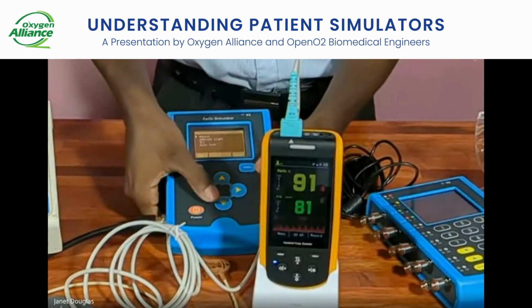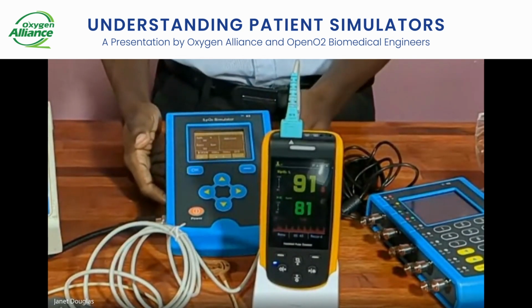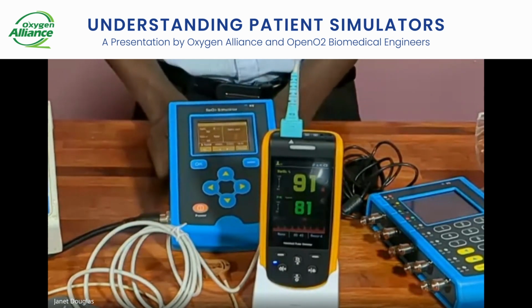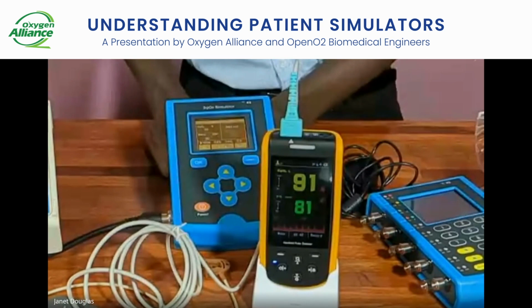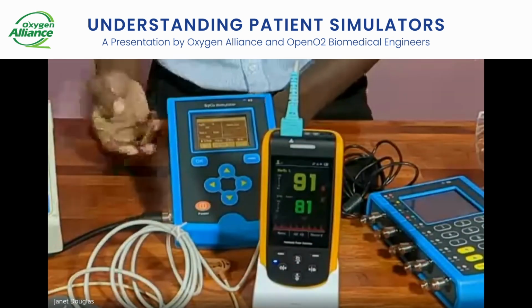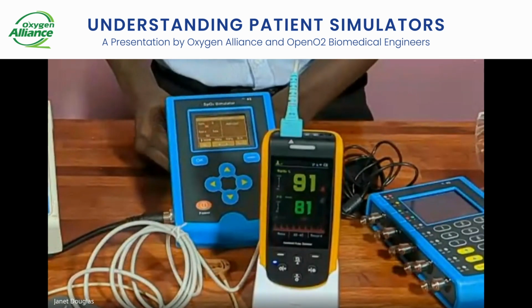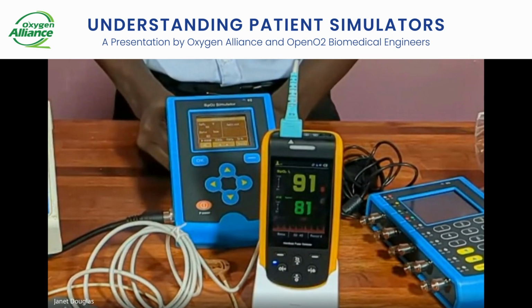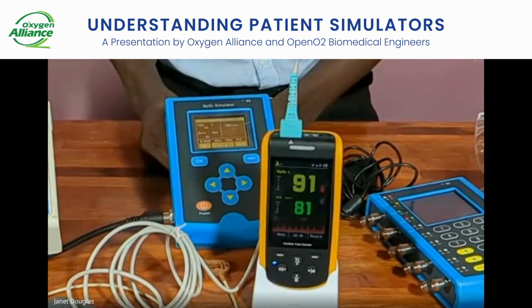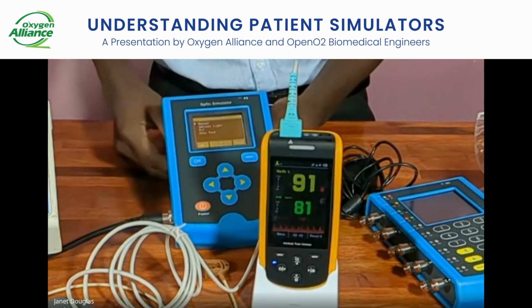I'll just quickly go through the other simulations. You also have the ambient light where you can simulate different lightings. This is to simulate different rooms. So if you're in an operation room or you're in another room, you might get different lightings in that environment. So you have 4 main options. When you click on the ambient light, you have the norm, the 60 hertz, and the sun. So these are the 4 different options when it comes to the ambient light simulation.